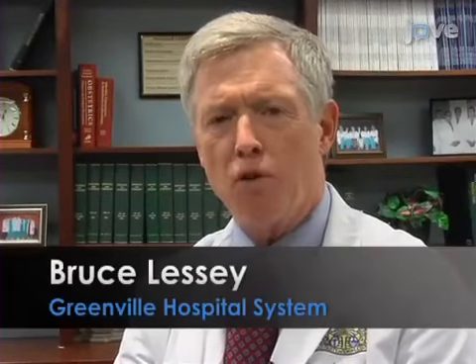The implications of this technique extend toward both the diagnosis and treatment of endometriosis, as it allows us to identify subtle and even invisible endometriosis that might disrupt the peritoneal surface and allow blood to have contact to the nerves underlying the tissues, explaining the pain that these patients are experiencing.